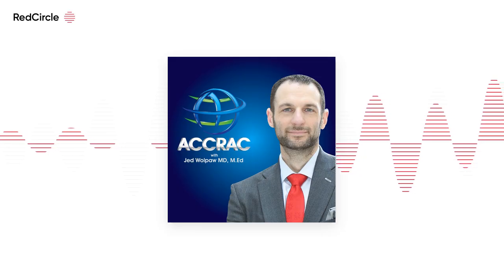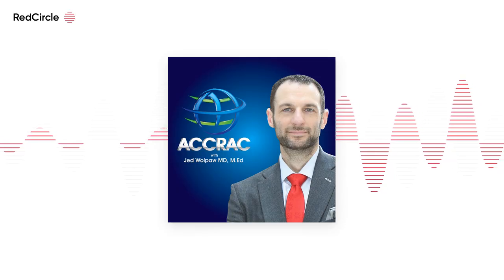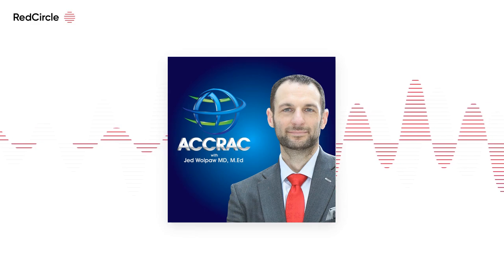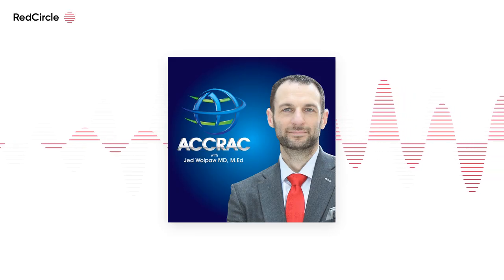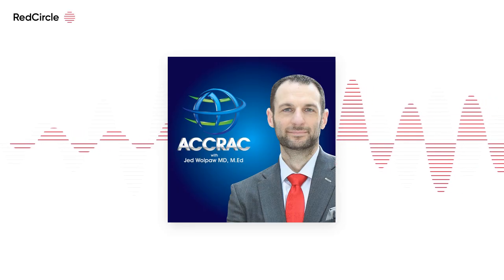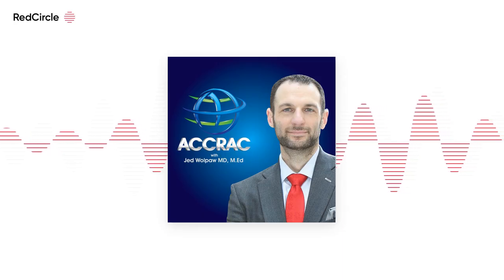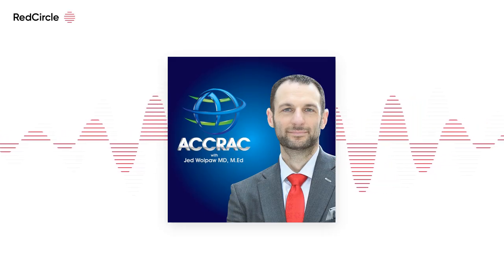Yeah, ideally you have to consider the pressure volume curve. A pressure volume curve is a compliance curve. It's mLs per centimeter of water. It just represents compliance. And we're typically taught that in open lung, you have a linear pressure volume curve, right? So if your pressure volume curve is linear, then you have many PEEP steps where your compliance is actually consistent. So you'll have a PEEP of 15, or let's say 14. We don't use odd numbers, right? Respiratory therapists hate odd numbers. So let's say you're at 16, you go to 14, driving pressure is the same. You go to 12, driving pressure is the same. It just means you're in a linear part of the pressure volume curve.